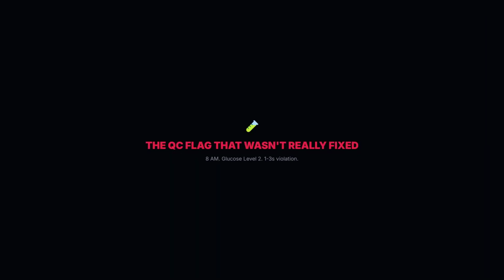It's 8 a.m. and your chemistry analyzer flags a 1 to 3s violation on the level 2 glucose control. You repeat it, it's still out, you recalibrate, and the next run passes. Case closed, except it isn't, because you never asked why the control failed in the first place.